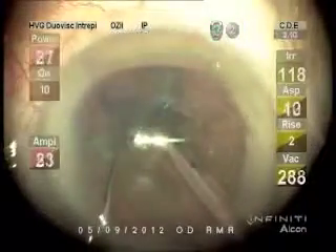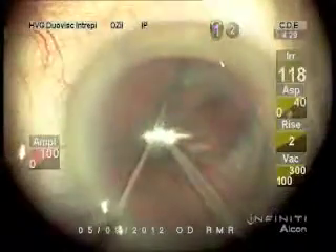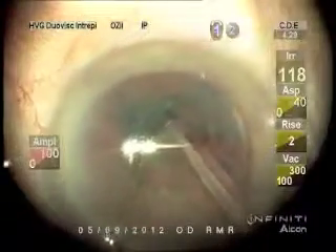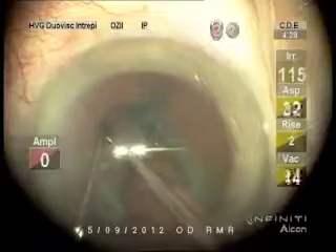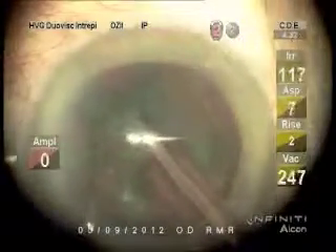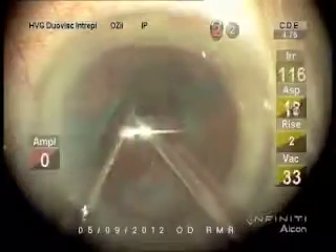I'd like to stop in the center for my fracturing. I'm going to break away segments.